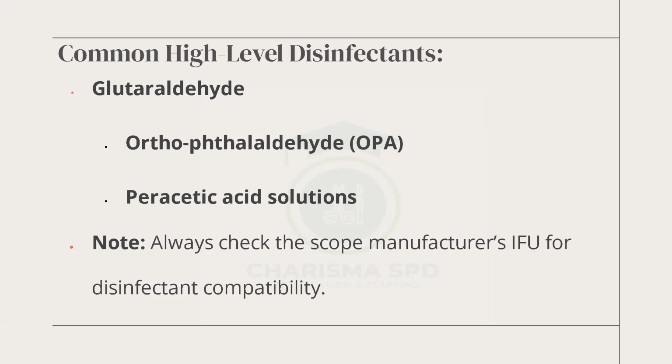So these are the commonly used high-level disinfectants that are in the system. The most common one you hear all the time is the OPA. That is not to say that you will not see other ones. They have new ones in the system. For the purpose of this study, the commonest one you will find is OPA. You will definitely get something related to that.